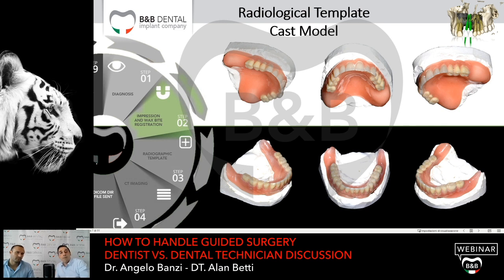So we have to decrease the level of the errors, and in this case, if you use a low retraction material, like a hard gypsum or epoxy resin, if you want, it is better than the normal material.